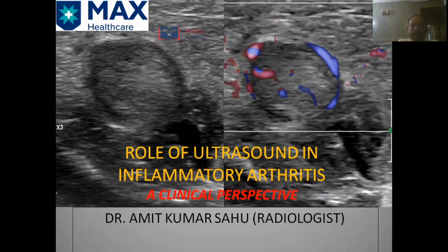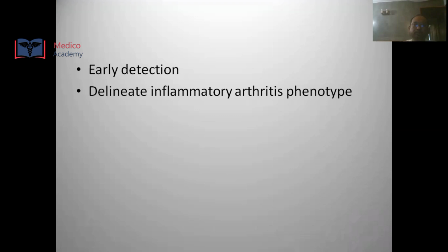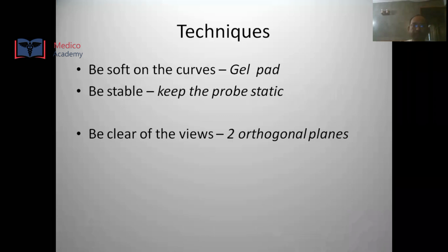Sahu, radiologist in Max Hospital, Saket, New Delhi. I will be discussing the role of ultrasound in inflammatory arthritis with a clinical perspective to it. So, there are two major indications of ultrasound in arthritis. One is the early detection of the disease and delineation of inflammatory arthritis phenotype.